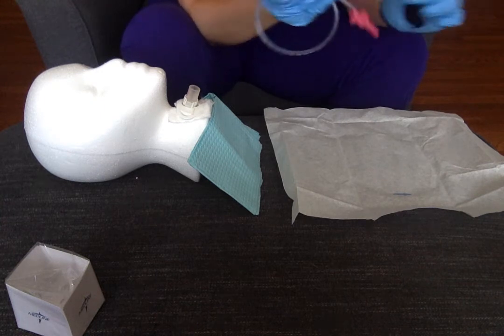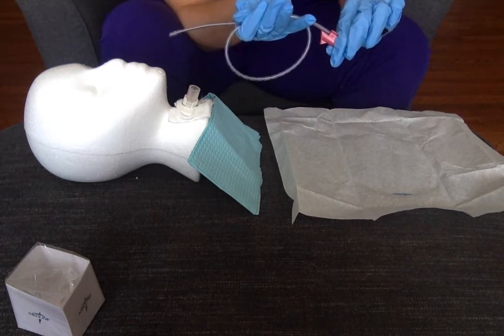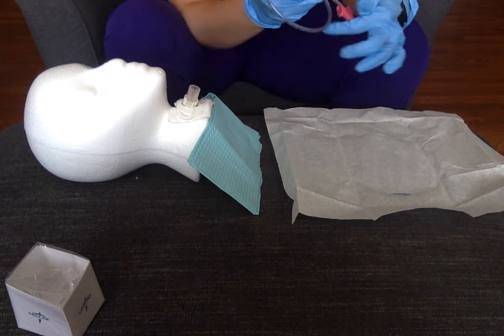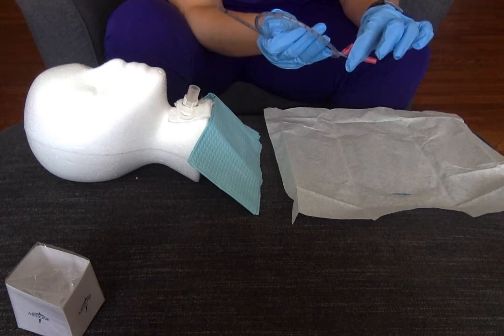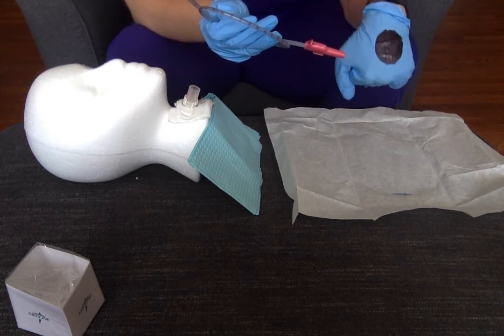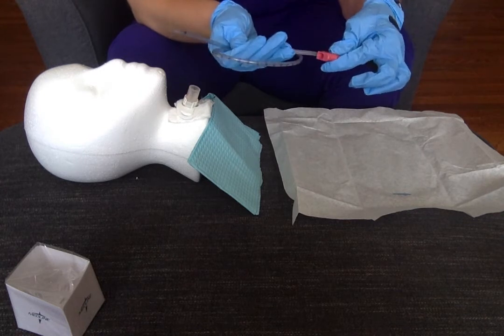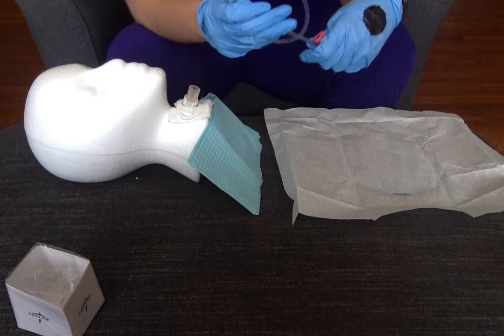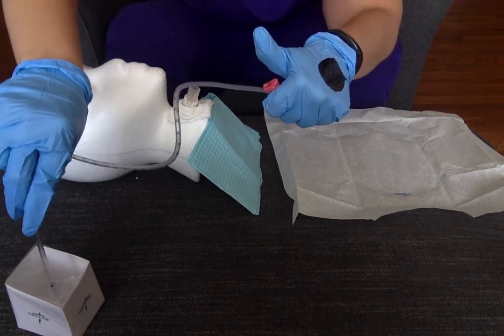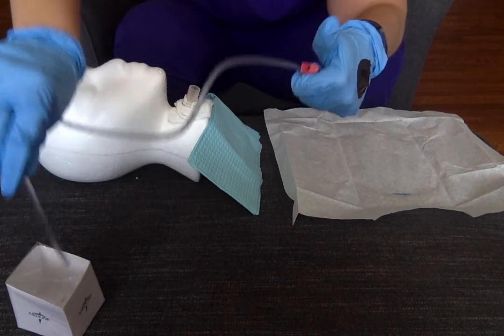At this point I need to hook my wall suction onto the catheter. I would grab the suction tubing with my dirty hand and hook it on. Then I want to check that my suction is working by dipping the end into the cup with a little sterile saline solution. This catheter has a little hole where my thumb goes over to activate suction. My left hand, because it touched the wall suction, is contaminated and can never touch the plastic tubing again — but it can touch this valve. When I tap over the hole, I should hear the suction and see water going up through the tubing, confirming suction is working.